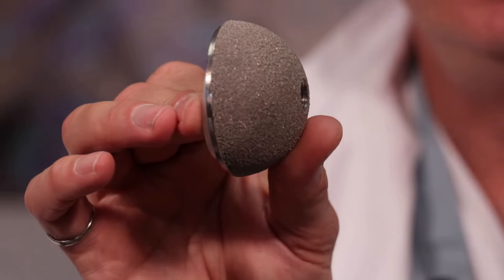Inside that acetabular component, we put in our bearing surface. And usually that bearing surface is high-density polyethylene — so really hard plastic. That just goes right inside it, snaps in, and that becomes your acetabular component. I'd say the vast majority of the time, a plastic liner is the bearing surface of choice.